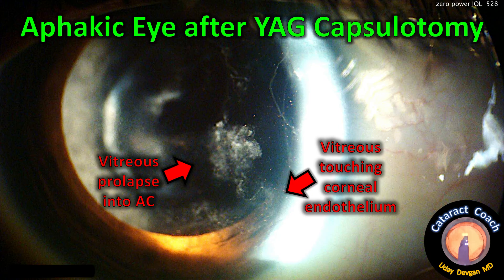And that looks great. Here is a good reason why you have to put a lens in. This is a photo of a previous patient who had surgery elsewhere. Because the eyeball power came out to be about zero, the surgeon elected to leave the eye aphakic. What happened is the posterior capsule became very opacified — fibrotic even. That surgeon then did a YAG laser capsulotomy, and vitreous prolapsed forward into the anterior segment. Now you have an anterior chamber full of vitreous. The vitreous is stuck to the corneal endothelium and it's causing endothelial cell loss.